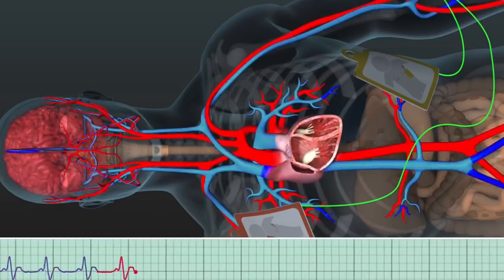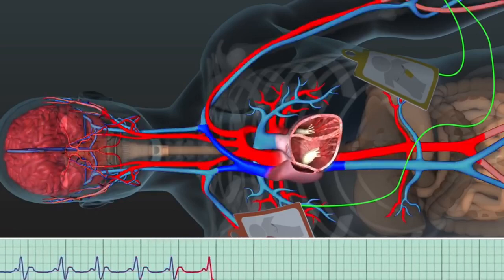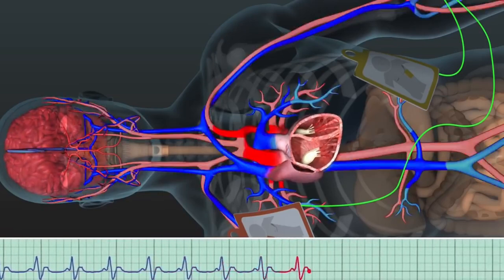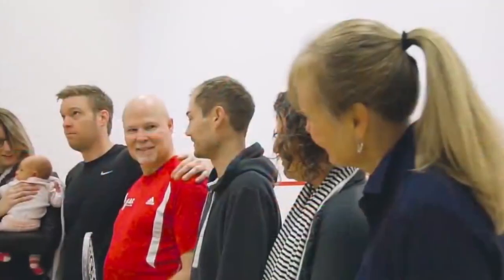In Steve's case, the ECG picked up a healthy rhythm, and therefore a second shock was not advised. In Steve's case, only 1 shock was required to bring him back to life. Steve's heart continues to beat, and he is alive and with us today.